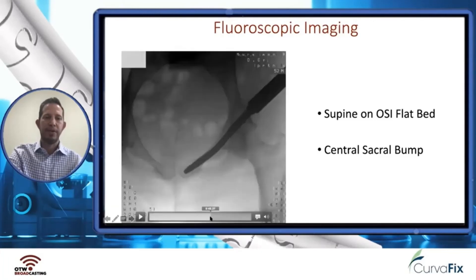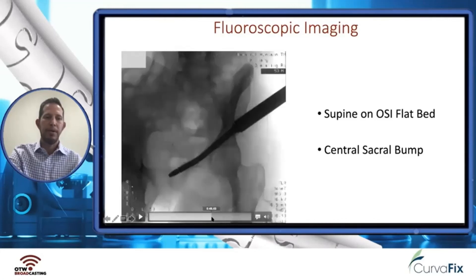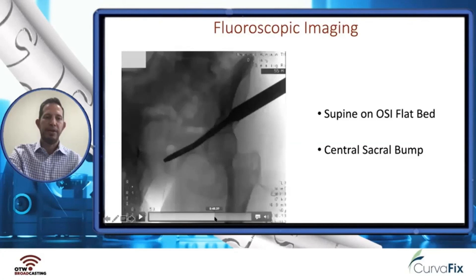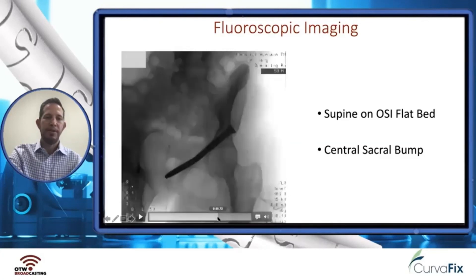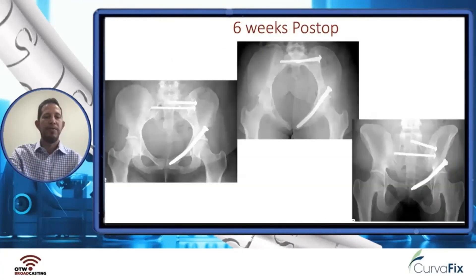You can see we have nice length, and how the curve allows us to accommodate this corridor. We tension it down, and there's a final inlet image and final obturator outlet image. Here are films at six weeks post-op with AP inlet and outlet views. She was made weight bearing as tolerated with a walker immediately after surgery, had pain resolved by about three to four weeks, and did well without any clinical events.